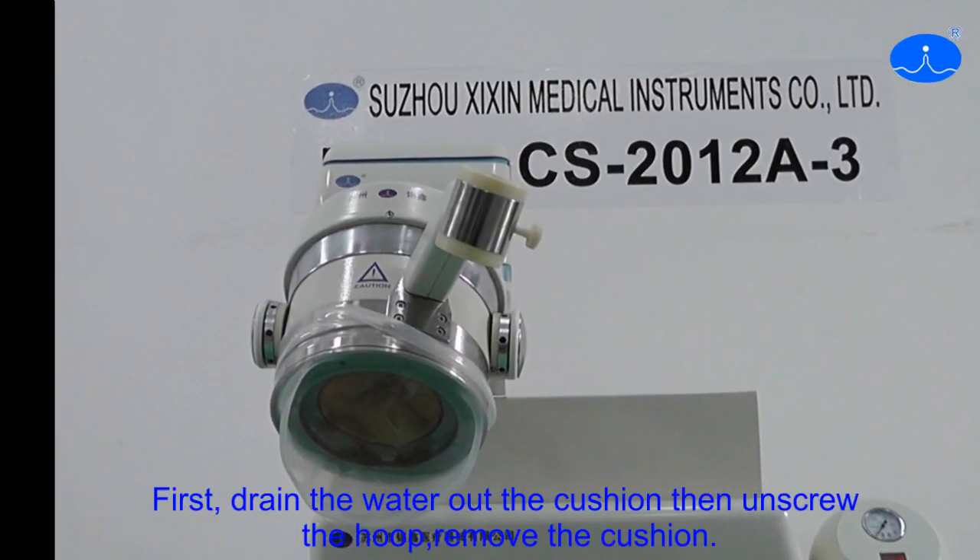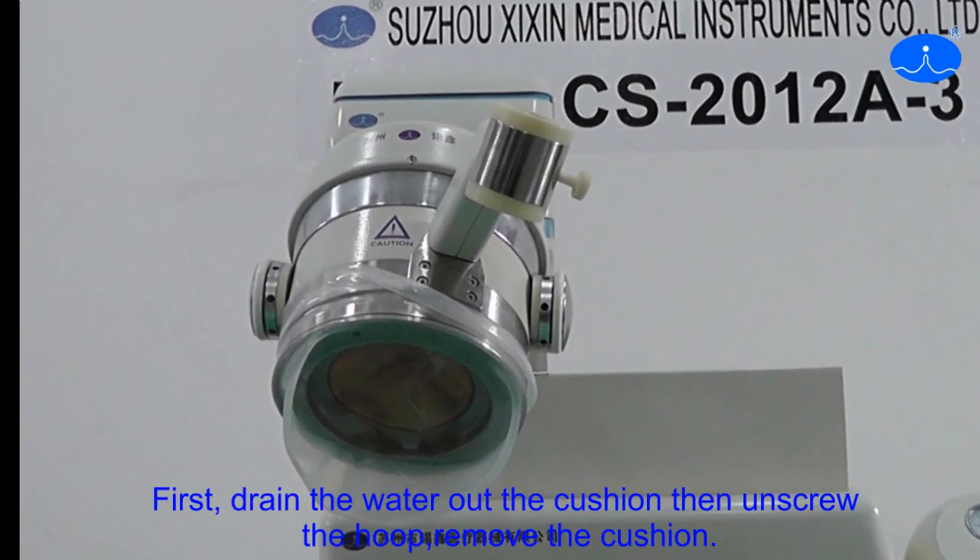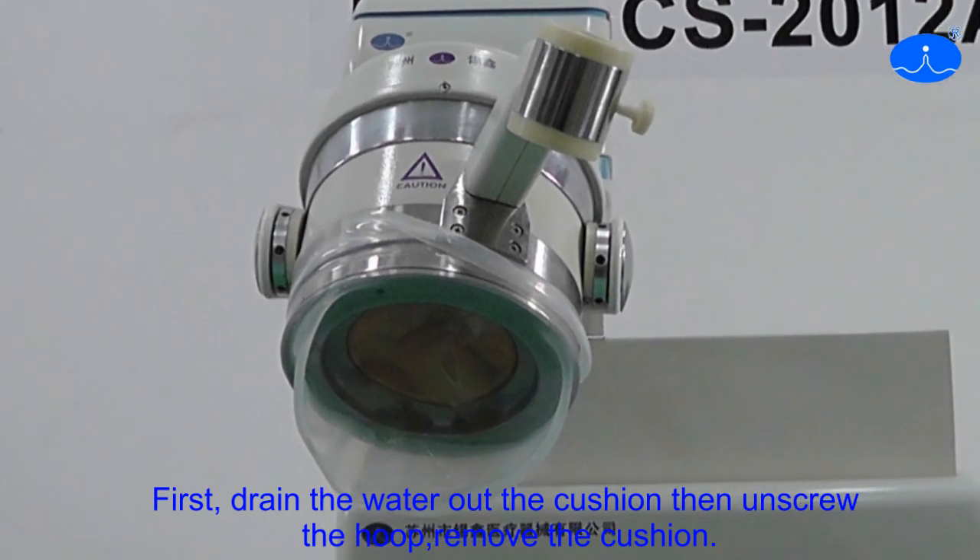First, drain the water from the outer cushion, then unscrew the hoop removing the cushion.